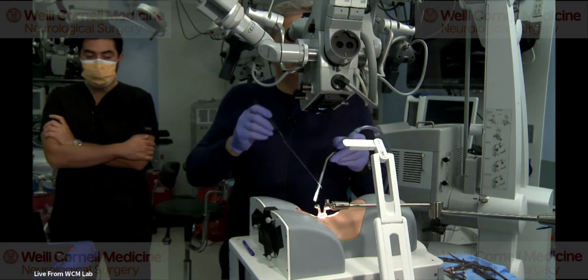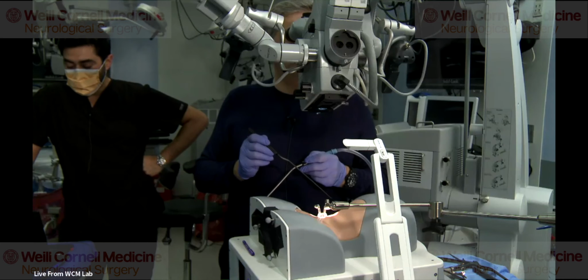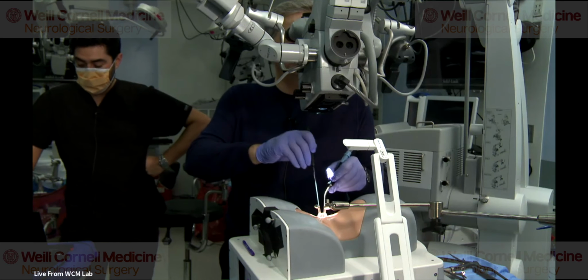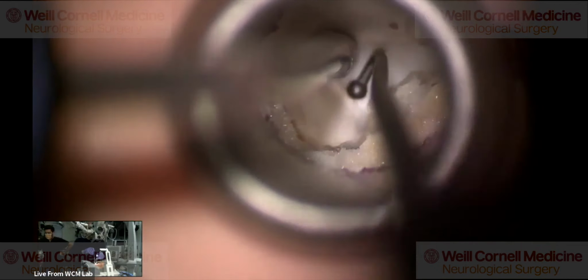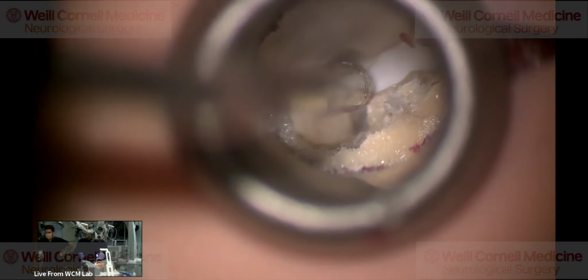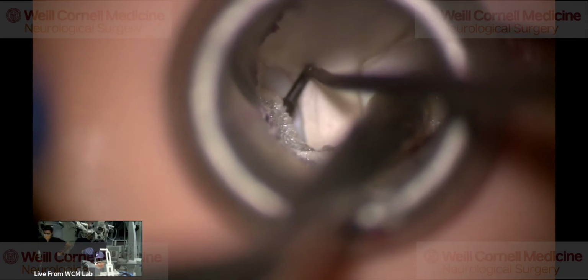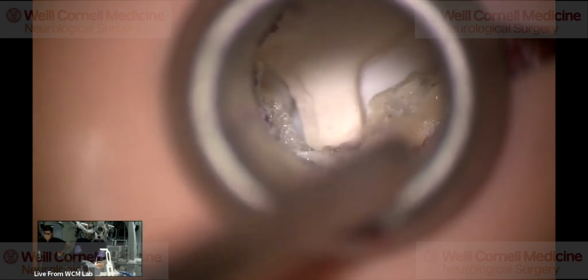I think this is pretty easy now because we don't have the bleeding factor. But how do you deal with your bleeding at this level, where you have the plexus? It's really very little bipolar coagulation. If there was bleeding here, I would feel comfortable with bipolar coagulation in this area to control that, and I would have the assistant irrigate at the same time. But usually what I do is I use small pieces of gel foam. Let's say there's a lot of bleeding here, I put gel foam here, and then I continue working, and I leave that, and I go to a different location and work there, and then go back to that location a few minutes later. So you kind of go back and forth.